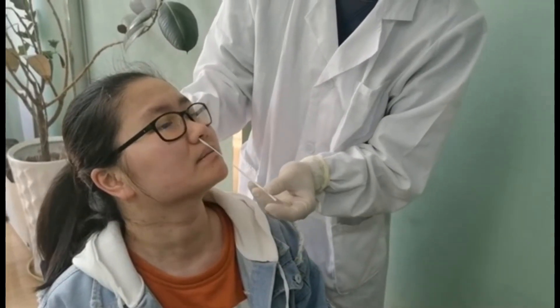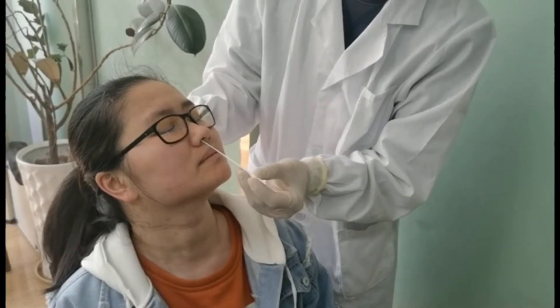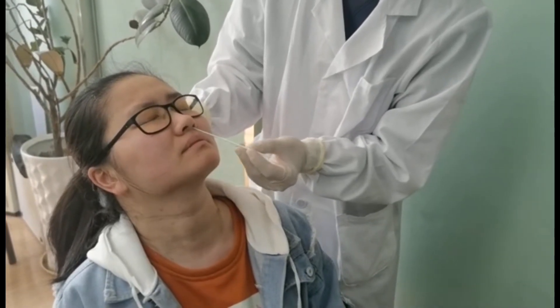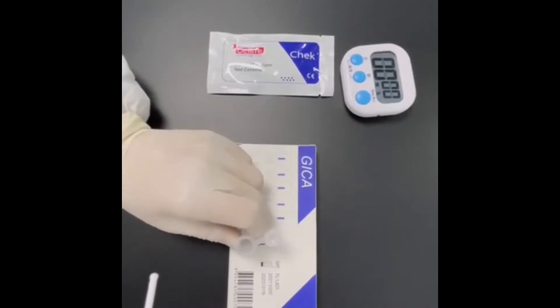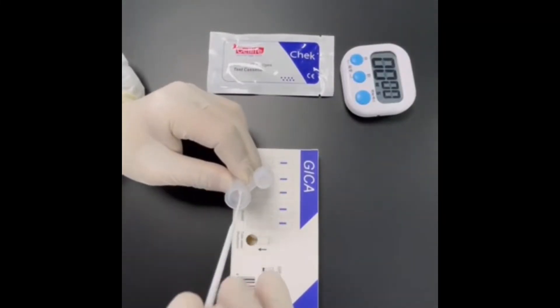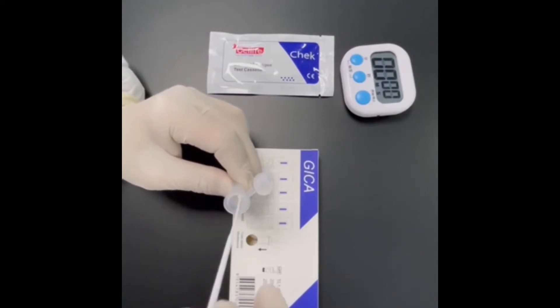Using the sterilised swab provided, take a sample for 15 seconds. Rotate the swab inside the tube for a minimum of one minute.